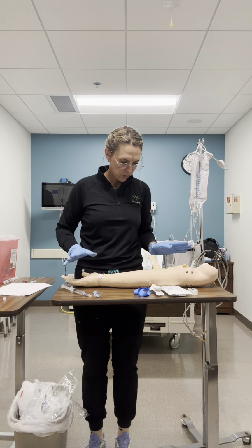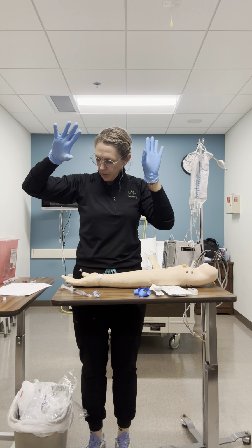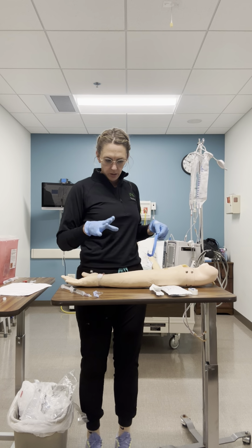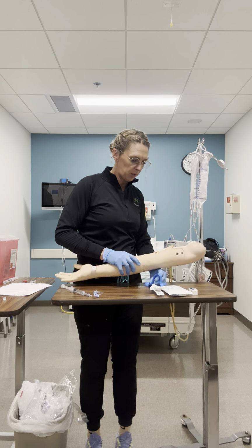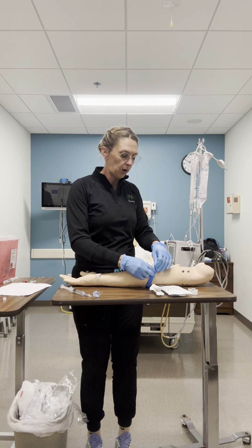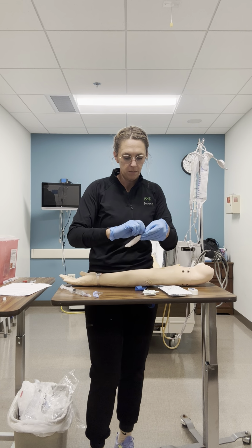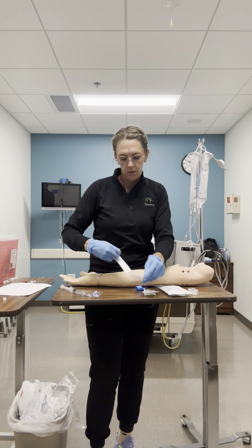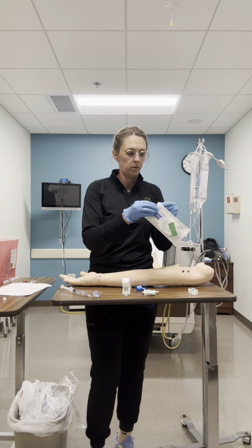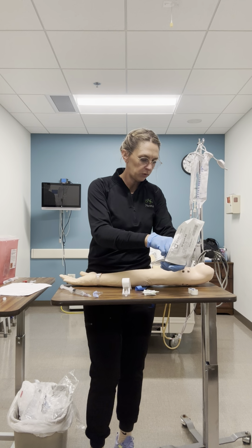Okay. I have all of that finished. So now I'm going to take my catheter out. First of all, I'm gonna make sure that all of my IV prep supplies are out and ready to go. So I have my supplies ready. Just gonna use a couple things from this start kit.